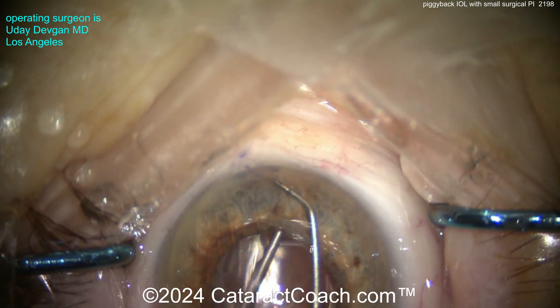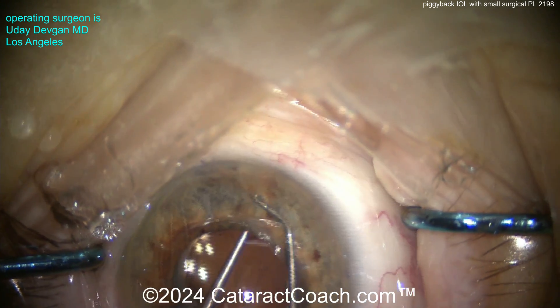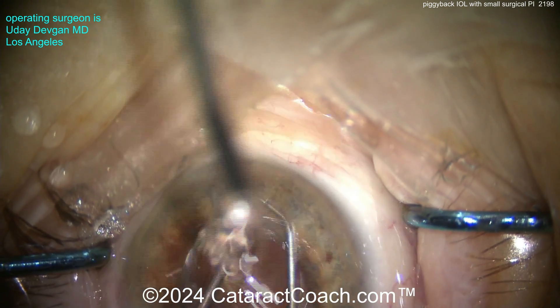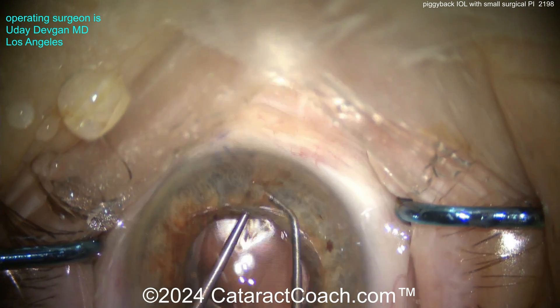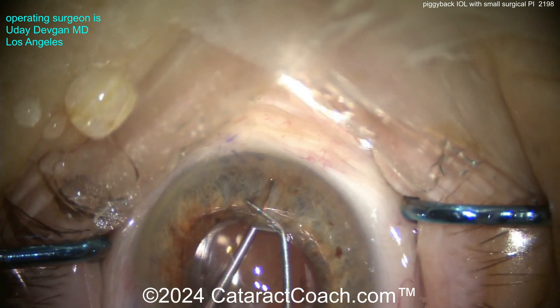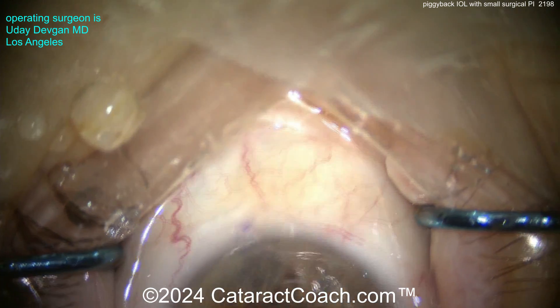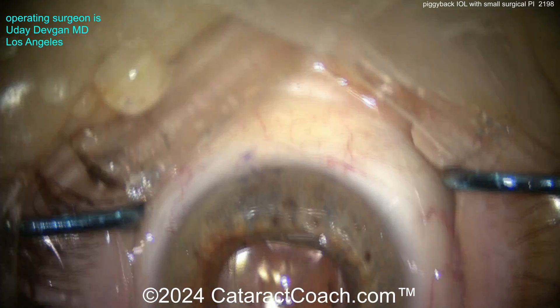Have the Sinski hook poke through — there it is, the tip of it. Once it pokes through, just pull the iris on either side to make sure you've got a hole pulled through. This hole will be sufficient. It's just a backup hole just in case, but again, I don't even think it's necessary. Most people doing piggyback lenses say they don't even do it. The Sinski hook is definitely through the iris, so that worked well. It could close up a little, but you don't need much flow through it anyway.